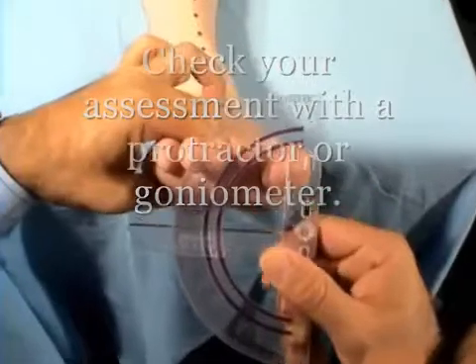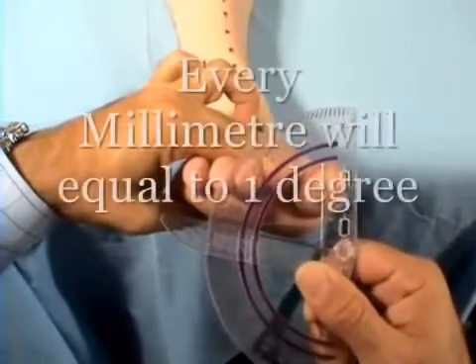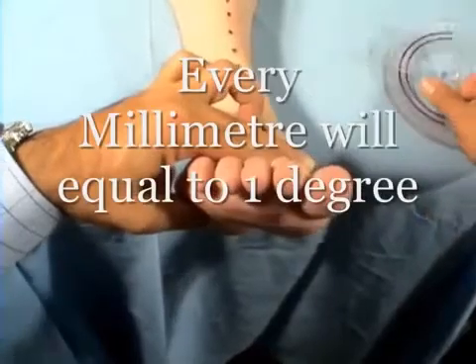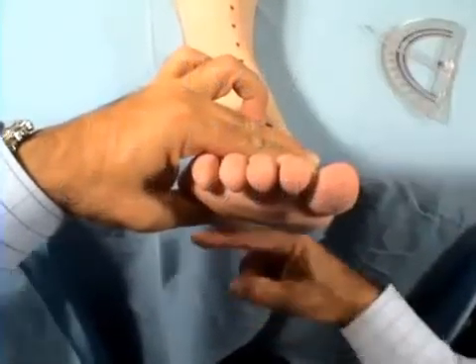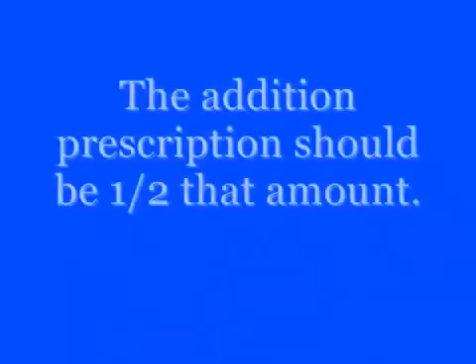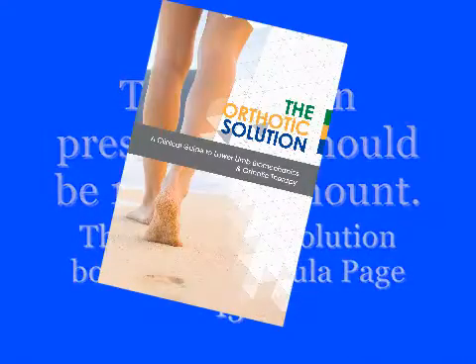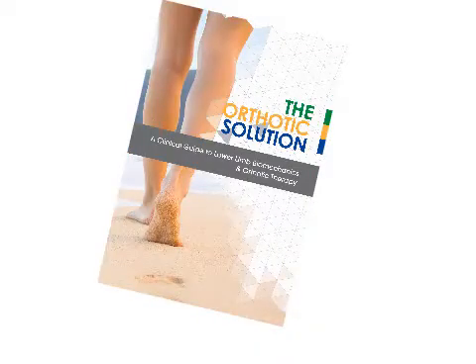Next, check your assessment with the protractor or goniometer to assess the degree of deformity in the forefoot. The correction should be half the measured amount. Refer to the orthotic solution book page 78 for a more detailed explanation.